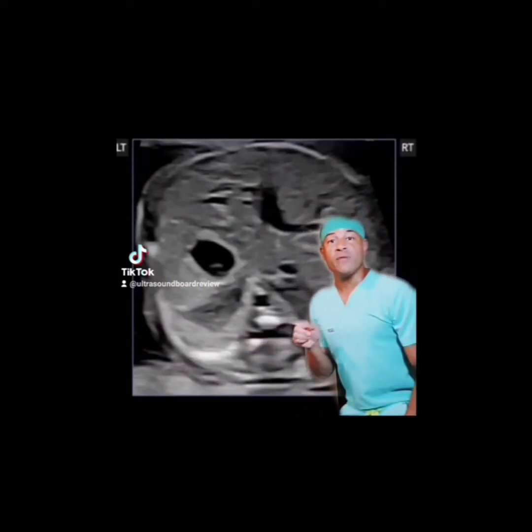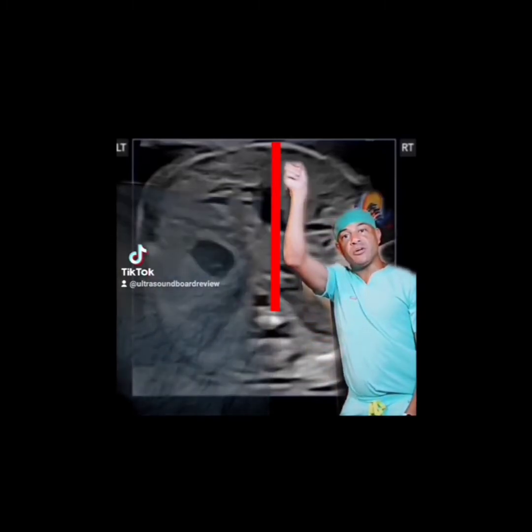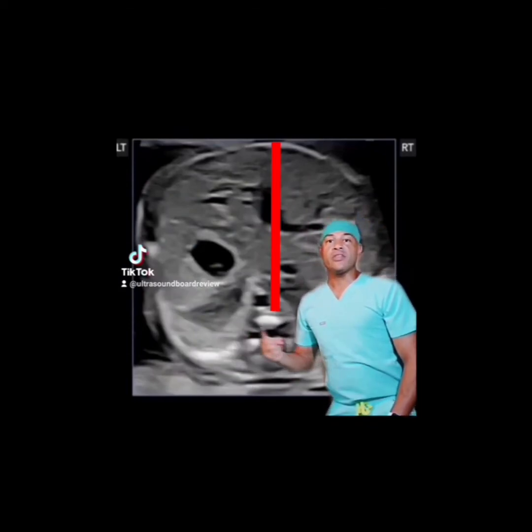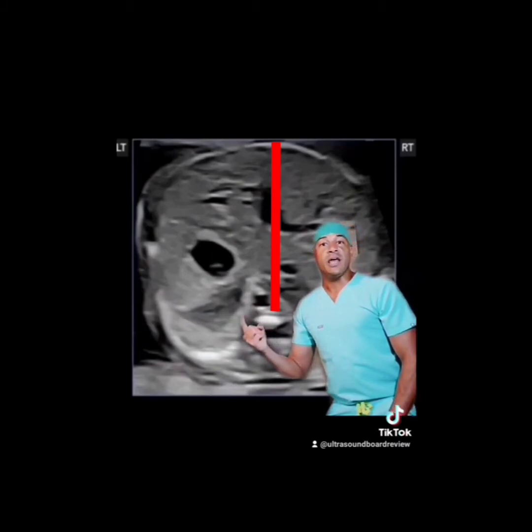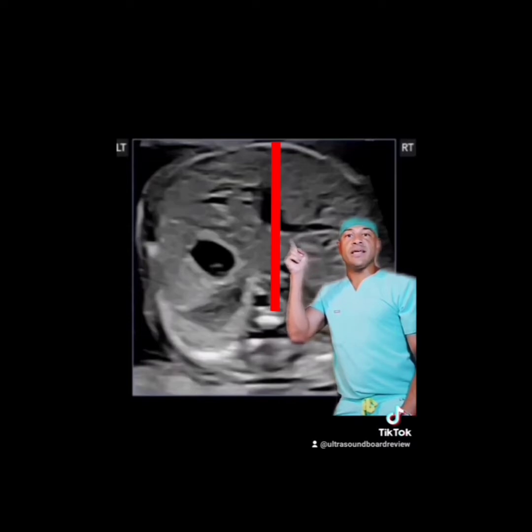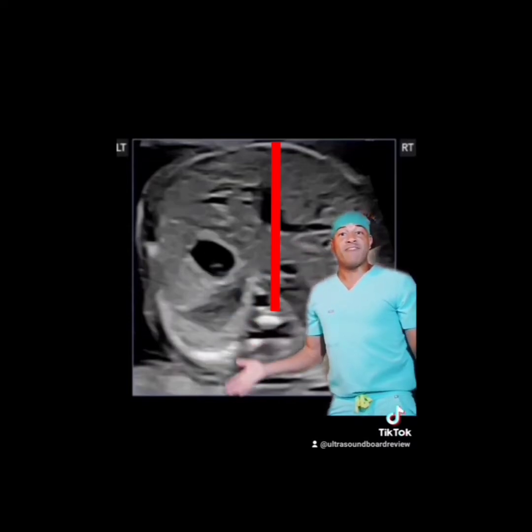For example, you have the spine here at 6 o'clock. What you do is just draw an imaginary line from the posterior portion of the baby to the anterior portion of the baby. This will divide the left and the right side. Now looking at the rest of the anatomy, we have the stomach on the left side, the aorta is posterior to the left, IVC is anterior to the right, and the portal sinus is L-shaped to the right. The only presentation we can decide from this is the cephalic presentation.